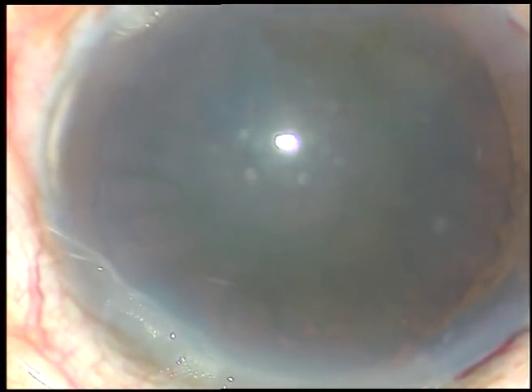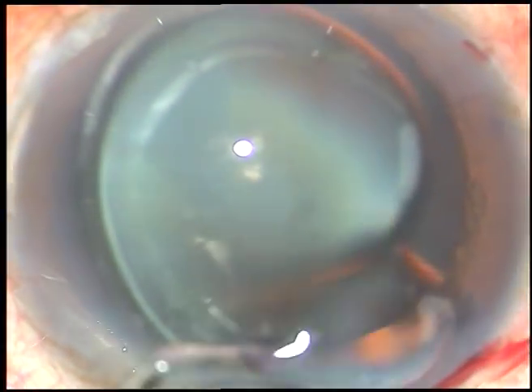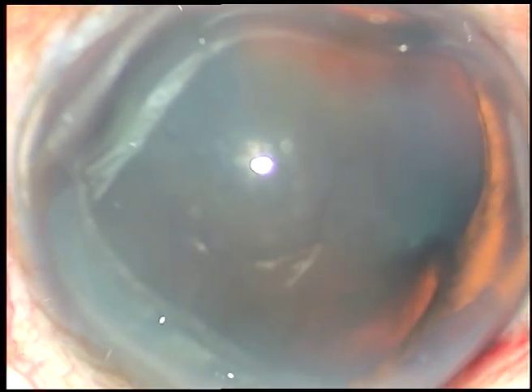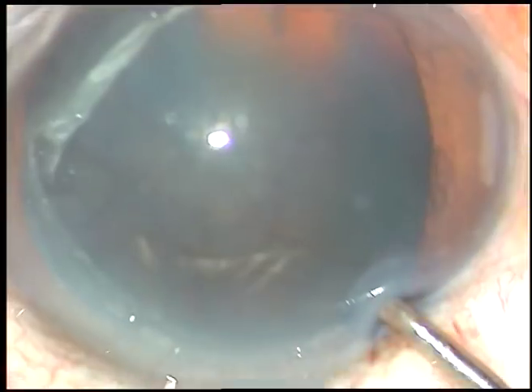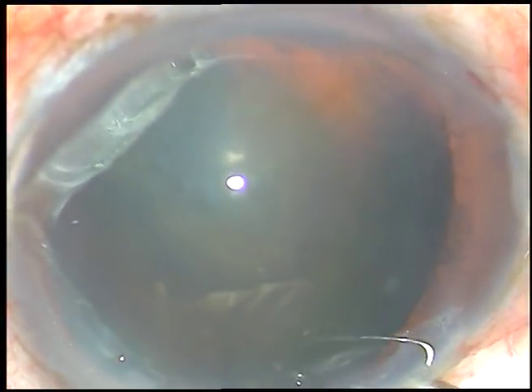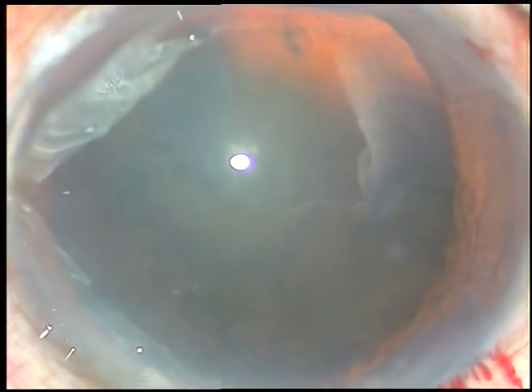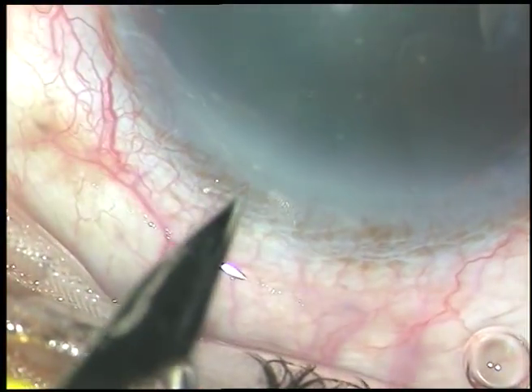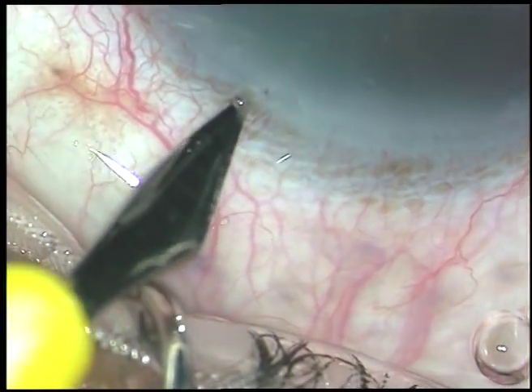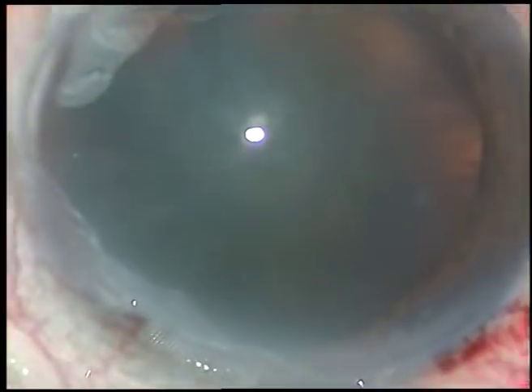Now viscoelastic substance is injected into the anterior chamber and it is sprayed over the epithelial surface of the cornea. The capsulorhexis is a very important step of phacoemulsification. This is a side port on the left side of the main incision, and now capsular rhexis is done — I usually cut the capsule and raise a flap.